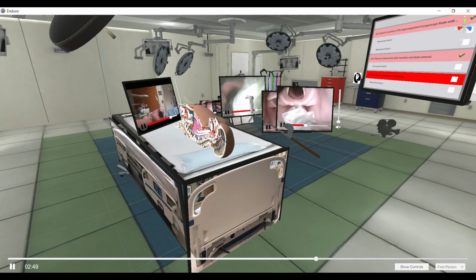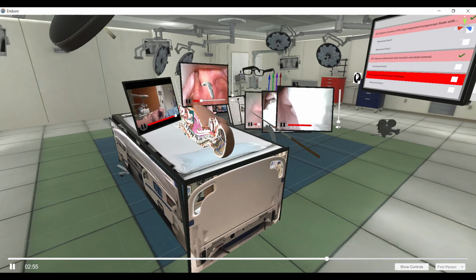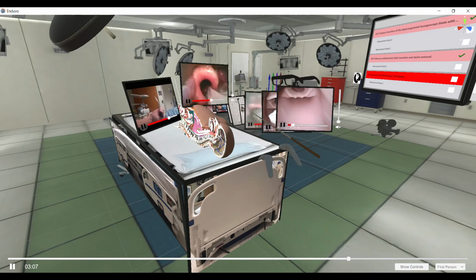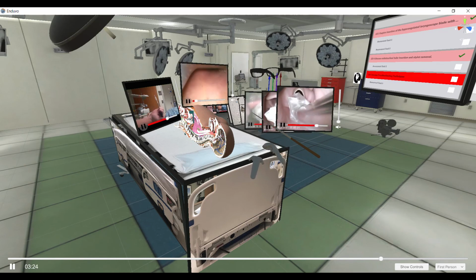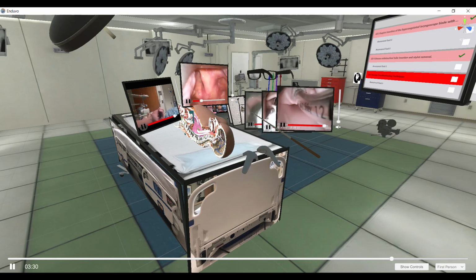All right, and now I'd like to move on to a second real life example. And in this example, you'll see that the intubator actually goes down to the right aspect of the airway. And then with a simple leftward adjustment of the video laryngoscopy blade, the epiglottis pops into view and they seat themselves in the vallecula. Again, I think they're probably a little bit too close, and that makes passage of the endotracheal tube a little bit more challenging than it needs to be. And by simply backing out, they could have potentially made intubation in this patient's case a little bit easier.